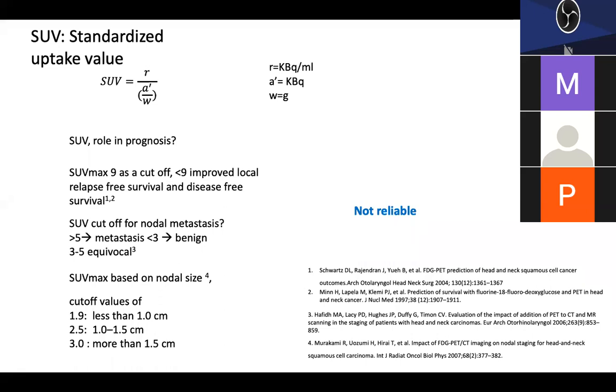Thank you, Dr. Sayak. Excellent presentation. I think by the time the residents will be posting questions, I have a couple of questions. One is, as you rightly said, CT scan has a moderate sensitivity and specificity for the primary lesion as well as for the nodal metastasis in head and neck cancers. So I wanted to ask you, what is the incremental value of PET-CT over CT for treatment naive cases, for nodal metastasis?